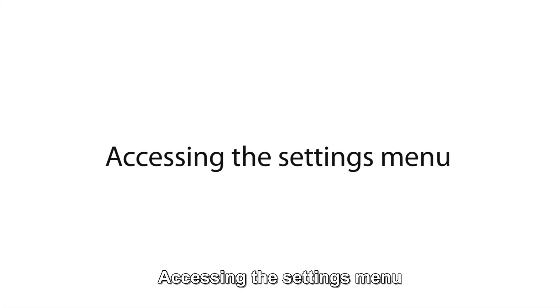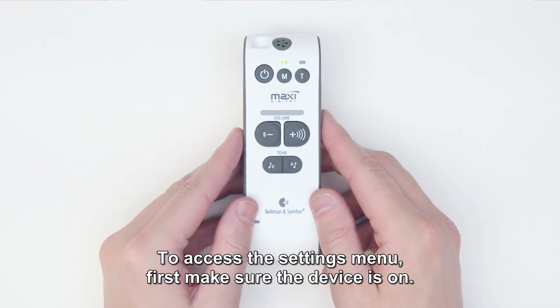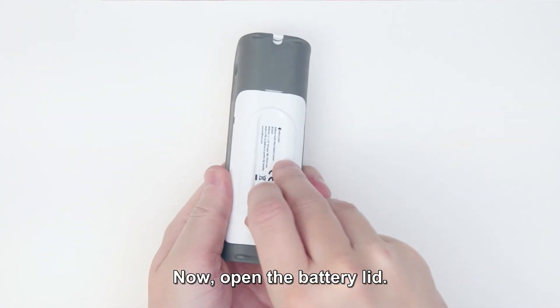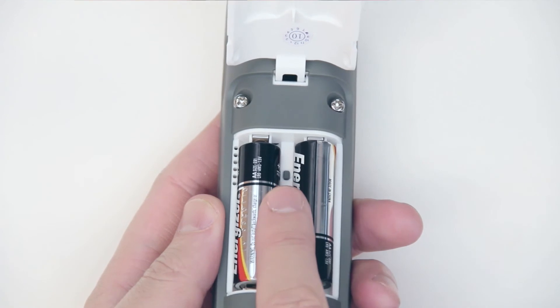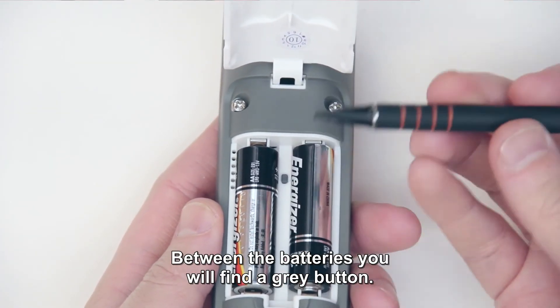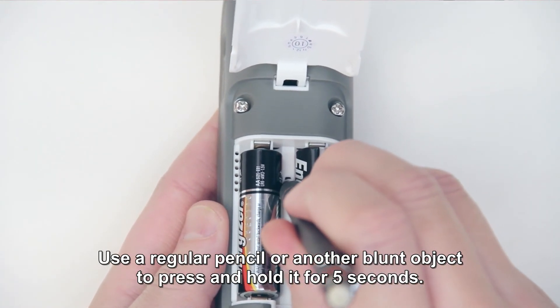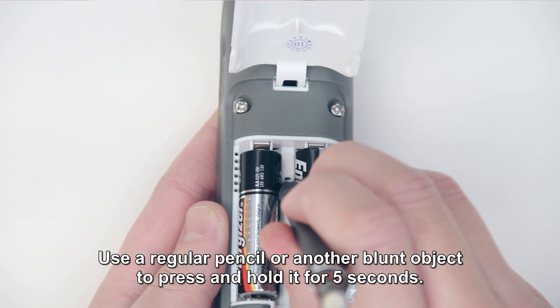Accessing the settings menu. To access the settings menu, first make sure the device is on. Now open the battery lid. Between the batteries, you will find a grey button. Use a regular pencil or other blunt object to press and hold it for 5 seconds.